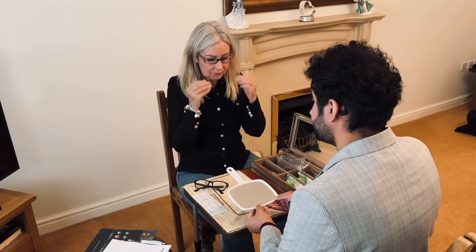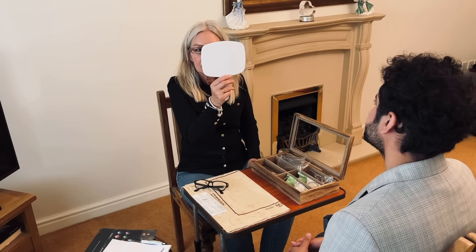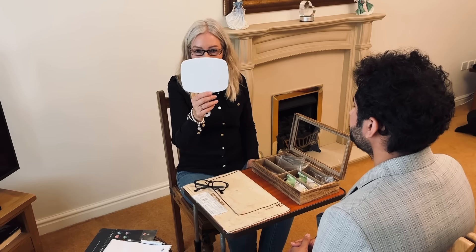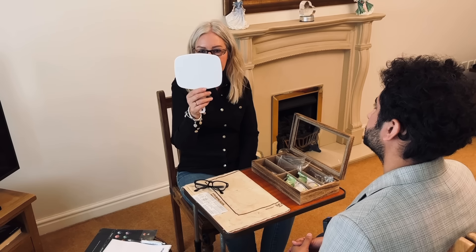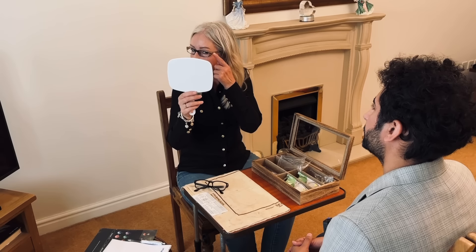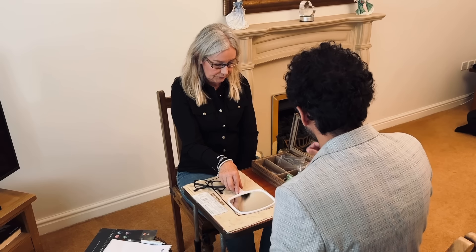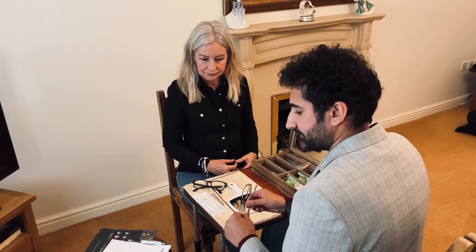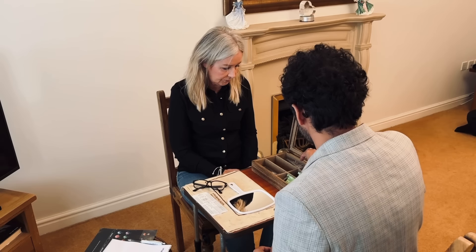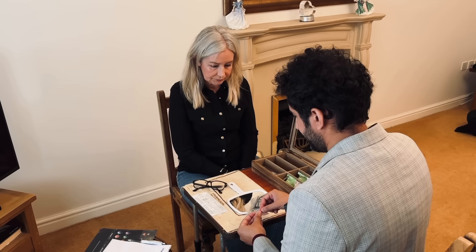There's a mirror there, and if you need to pop your glasses on to have a look at them in your hand, that's fine. I think I prefer something — I like the frames, but perhaps the frame a little bit bigger. Yeah, they're on the narrow side. But I do like the colour as well, not too dark, but I think I need perhaps a little bit bigger of a frame. Nice and lightweight.